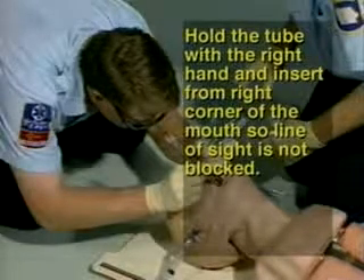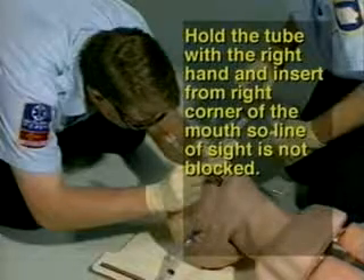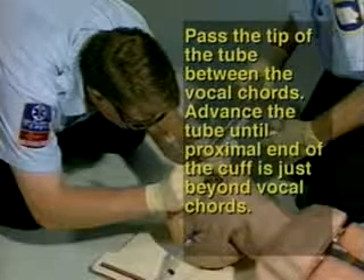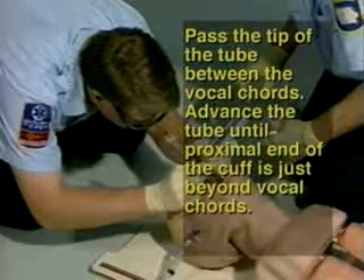Step 13: Hold the tube with your right hand and insert from the right corner of the mouth so the line of sight is not blocked. Step 14: Pass the tip of the tube between the vocal cords. Advance the tube until the proximal end of the cuff is just beyond the vocal cords.